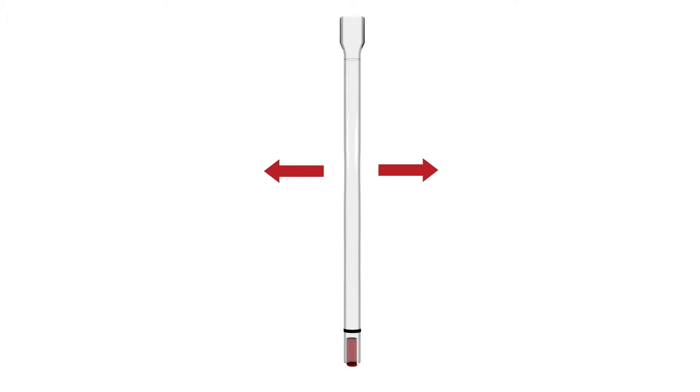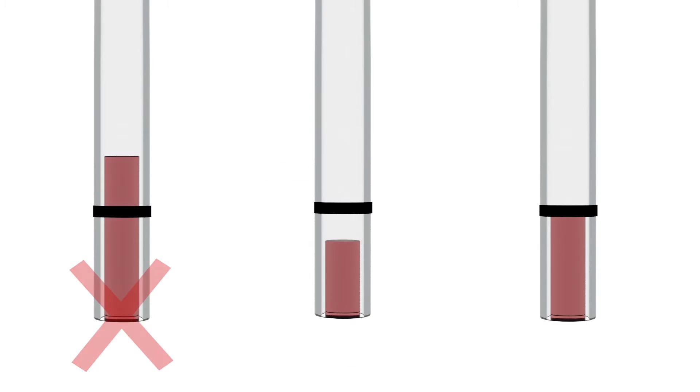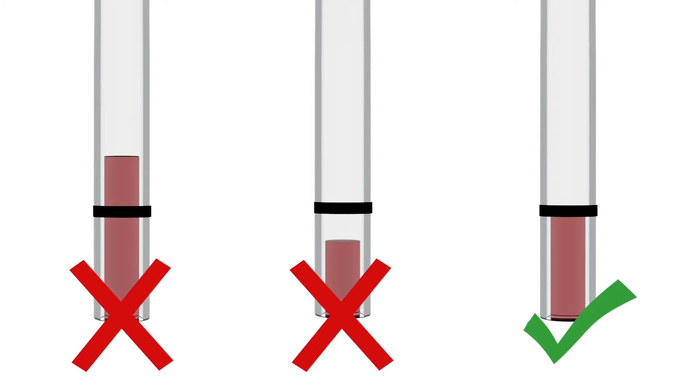Allow blood to fill up the pipette to the black line on the tube. Be careful not to overfill or underfill the capillary pipette.